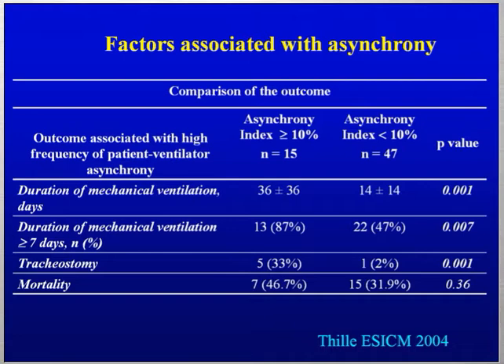So we didn't want to change anything. The level of intrinsic PEEP would have been interesting. It will be the matter of a second study to try to clearly describe these patients physiologically and see what can be done and if it's possible to do differently individually.